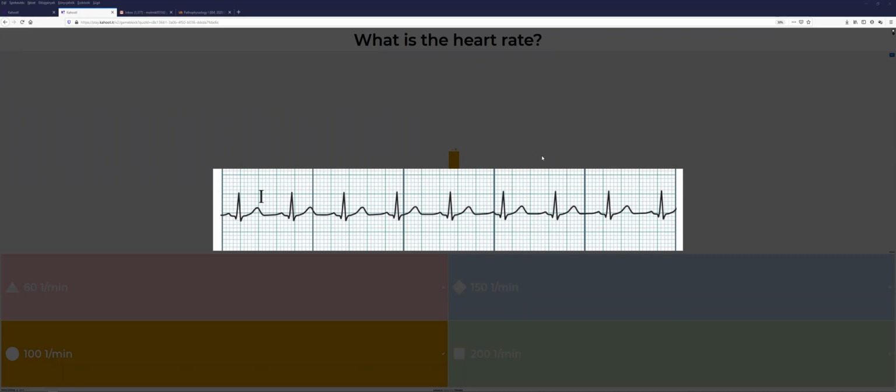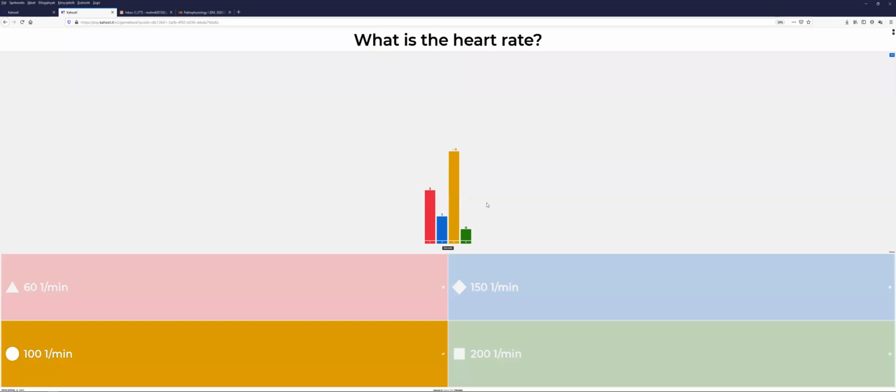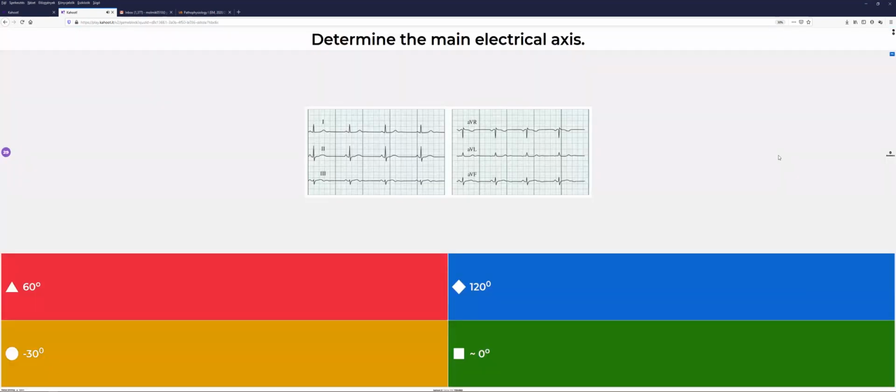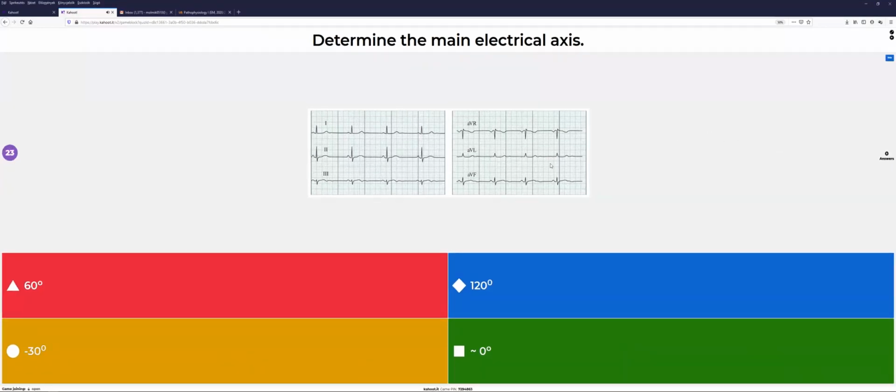Very good. Can you see the ECG strip, and whatever the answers? Yes. Good. All right, because I do have a very wide screen, I have no idea what you can see from this one. Okay, the ECG was the first one. Good. Now let's see the other one. Determine the, all right. Okay, no, I cannot enlarge more.